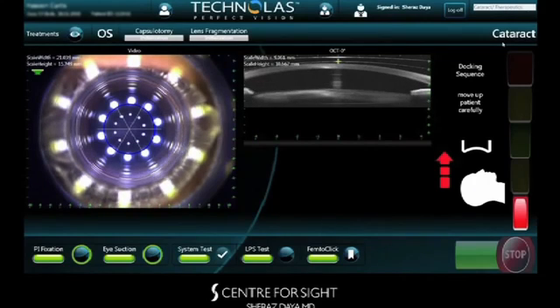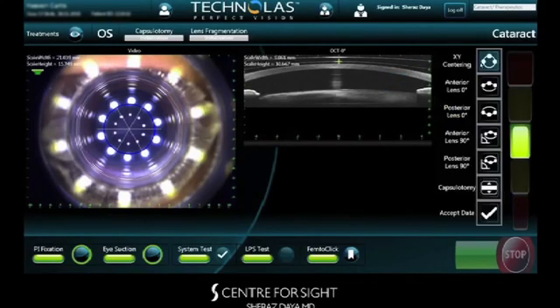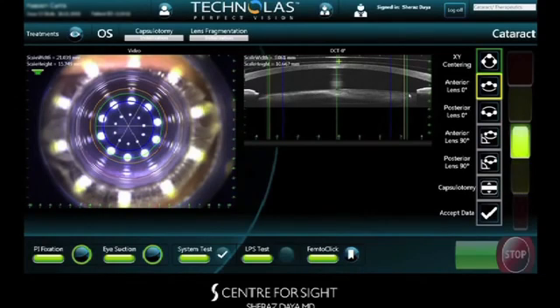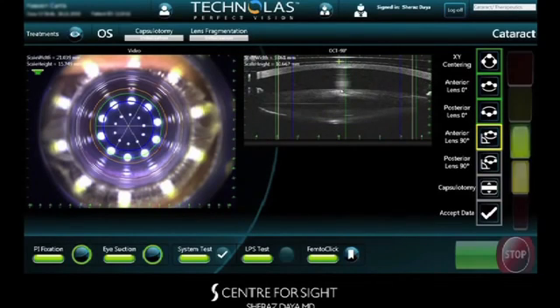The upper image shows the posterior edge of the interface and immediately underneath the cornea. The anterior capsule of the lens is also shown here. Centration of the capsulotomy is confirmed by outlining the iris. The anterior edge of the capsule is then marked at 3 points in the 180-degree meridian. The posterior capsule in this meridian is also demarcated. Similar landmarks at 90 degrees are also identified.